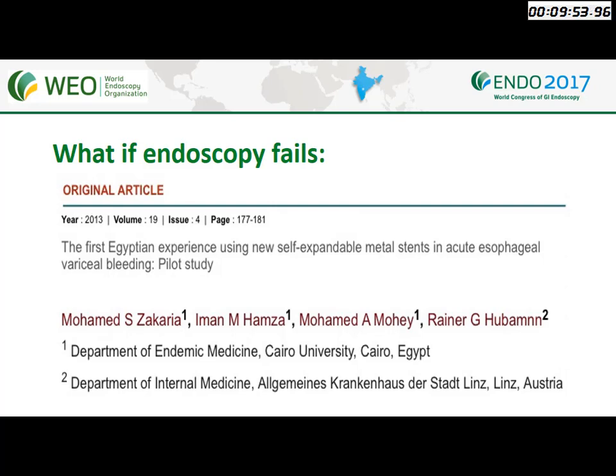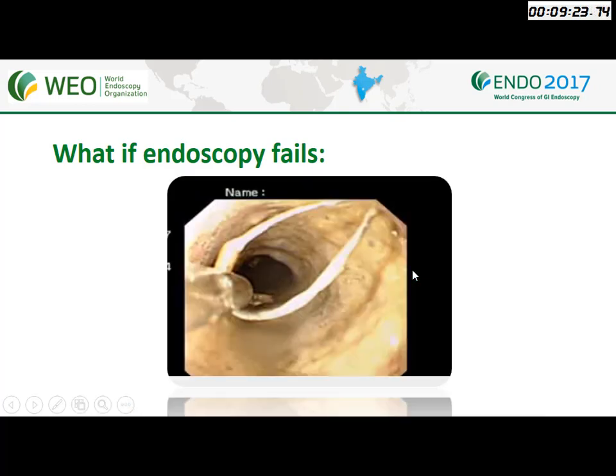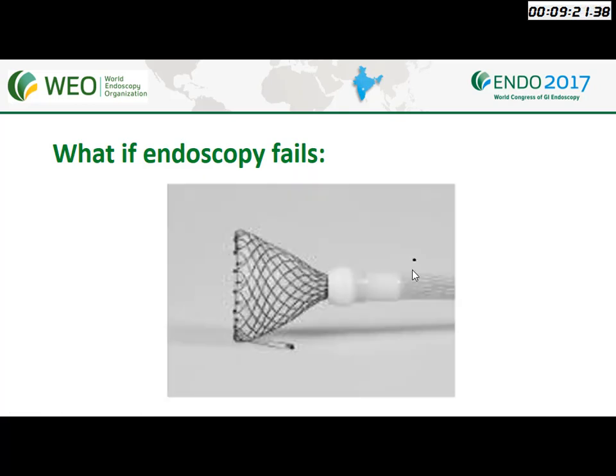It was successful, but number one, it is very expensive. Number two, if you can inject and give better treatment, you can cover the patient. But you have to be ready with alternatives if you fail to do endotherapy. This is some pictures with the applied covered stent, and here is how to remove it.